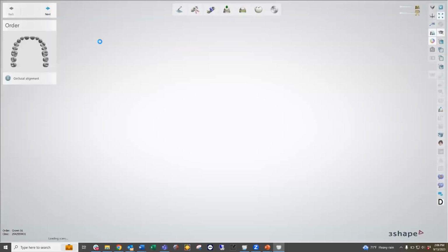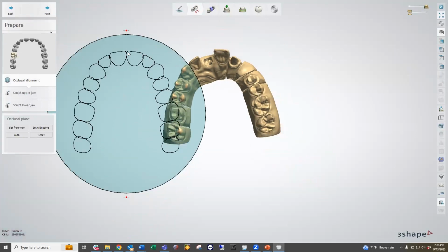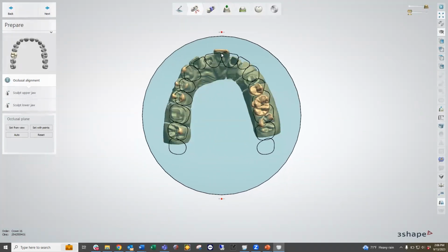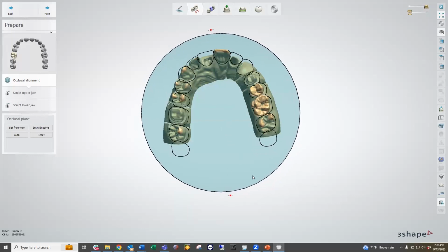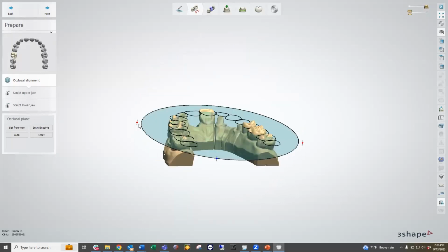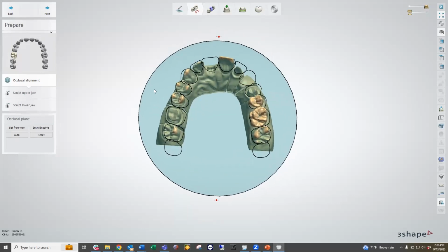When we have scanned a case, the first thing that we're going to do is prepare the order, which is basically taking the scans and aligning them into the development that we have here as far as an arch goes. I'm just going to idealize this arch over the location. This will help us when we go through the excursion and protrusion movements we have with our virtual articulator that we're going to talk about a little bit later. The prepare step allows us to adjust this occlusal alignment, which is basically putting the teeth inside this preform to idealize it within the virtual setup.